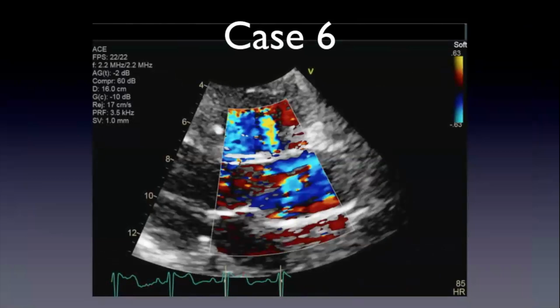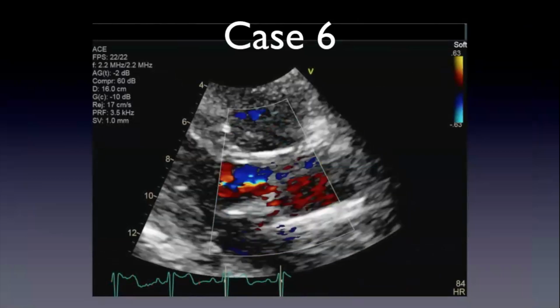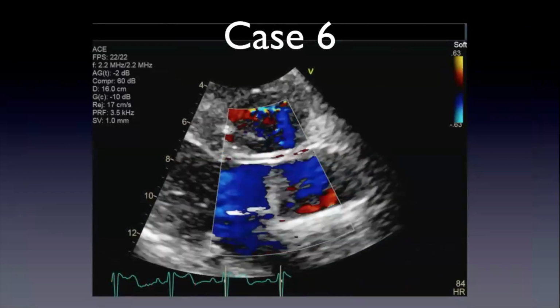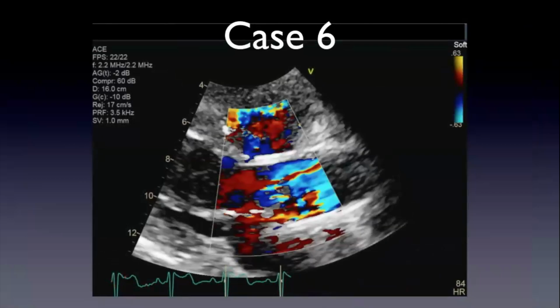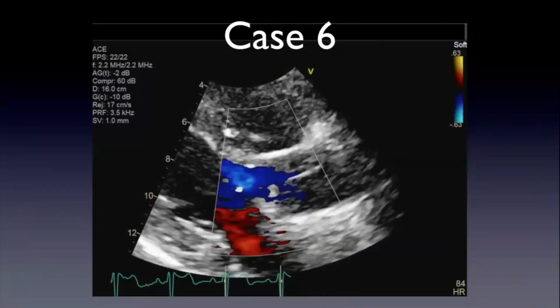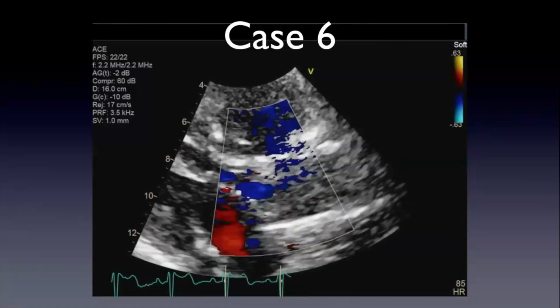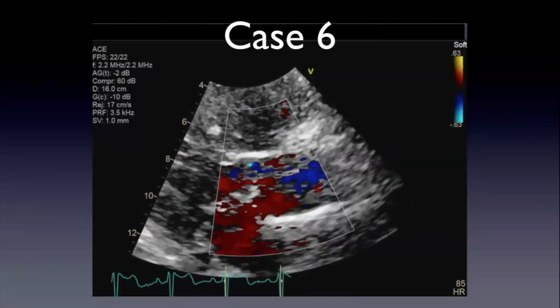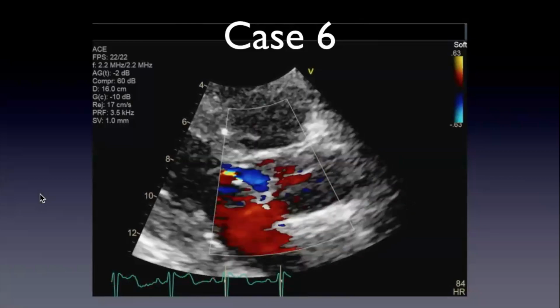Just looking at this, we'll start at the bottom of the mitral valve, not really seeing any sense of vegetation. Again, the sense that there might be a jet of aortic insufficiency there. Trace to mild. And then looking in the RVOT, there is certainly some color there. It's very splashy. I don't know whether that's flow going out of the RVOT or is there a connection to the LV and RV there.